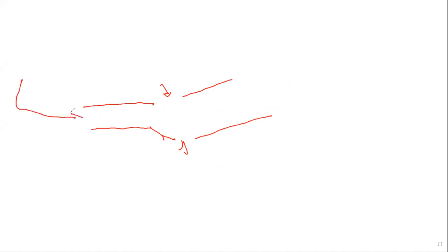Okay, so the device known as a Venturi mask is designed this way. There are openings over here, openings over here. And the purpose of this is from the wall, oxygen goes over here. How many percent of oxygen is coming from the wall? 100%. Okay. So the 100% is going over here, but we have air that's 21% mixing with it over here for final delivery to the patient.